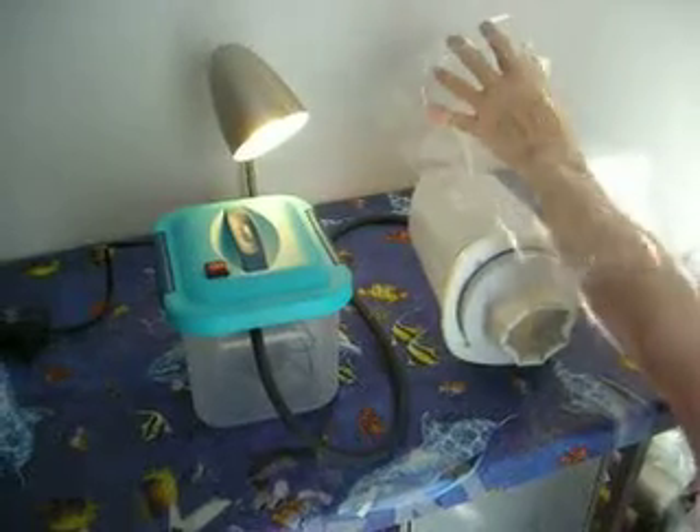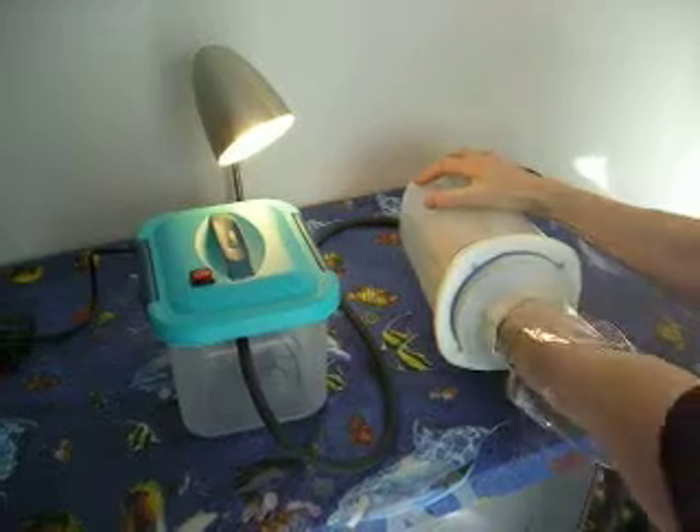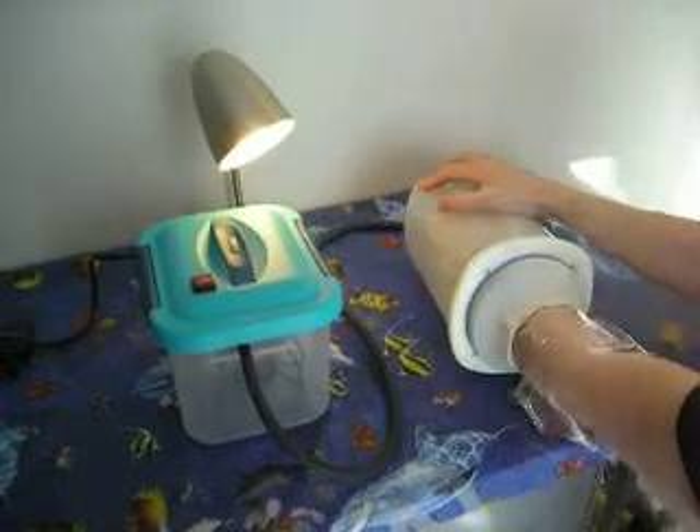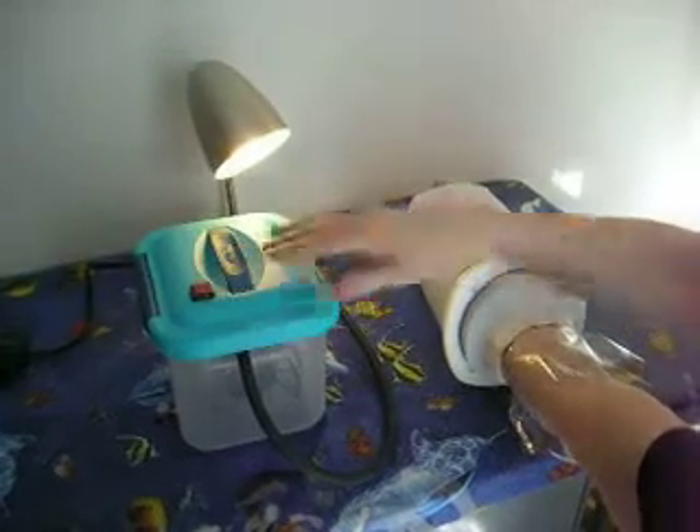The limb is placed in the sterile bag and the hand placed into the vacuum chamber. Turn the vacuum pump on for 10 seconds.